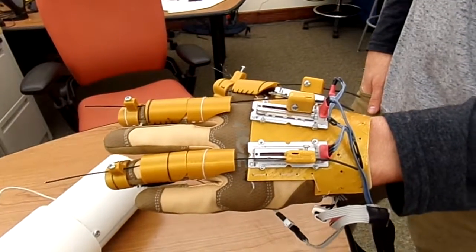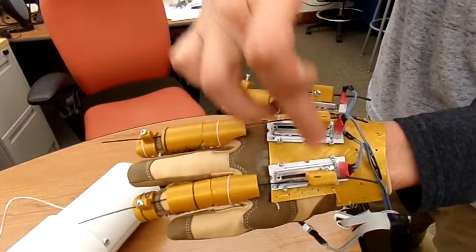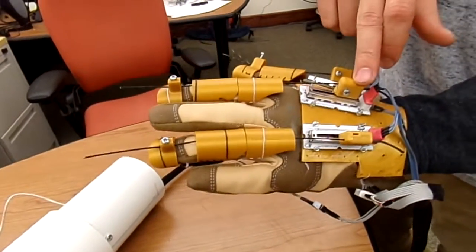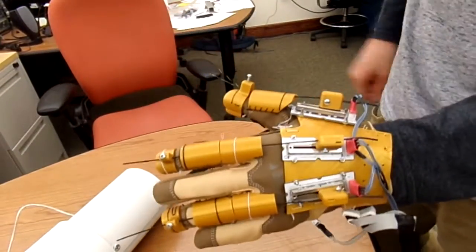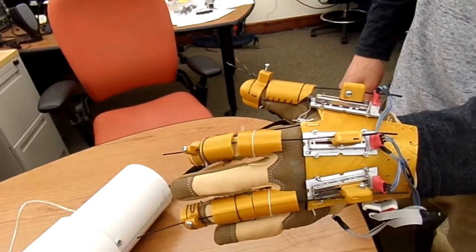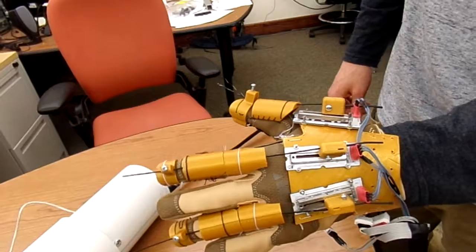This is our contralateral hand with which we control the ipsilateral prosthetic hand. We have a total of 4 sensors on this, 3 linear potentiometers, and 1 accelerometer on the palm. Each linear potentiometer is attached to a piece of Bowden cable which runs through the top of each finger and is attached at the fingertips. The Bowden cable allows us to pull the linear potentiometer as we flex a finger and thus determine the flexion that we want in the fingers of our prosthetic hand.